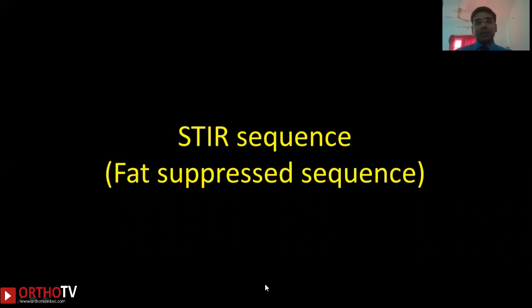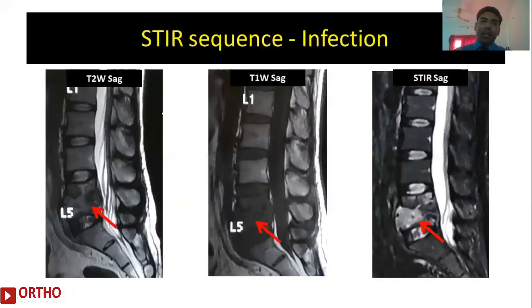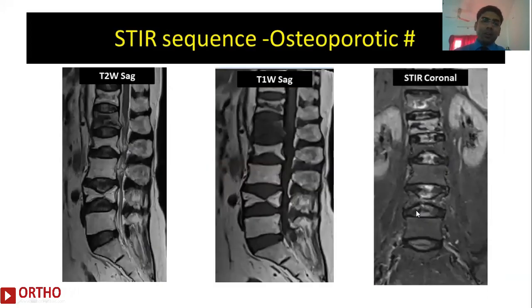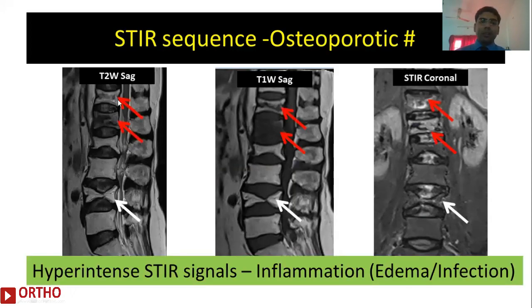Sometimes we utilize STIR sequences, which are fat-suppressed sequences. The STIR is similar to the T2-weighted image except the fat component is suppressed. This makes it an excellent sequence for visualization of fluid, especially in cases of infection or cystic collection around the spinal cord. It is also important for differentiating new and old osteoporotic fractures. You can see a patient with multiple osteoporotic fractures: the vertebral bodies marked with a red arrow show a hyperintense signal indicating recent fractures, whereas the vertebral body marked in white is hypointense, indicating an old fracture.